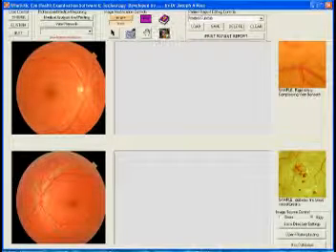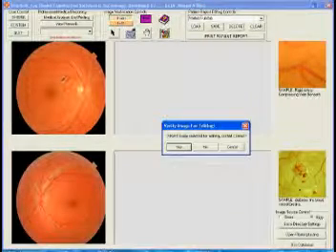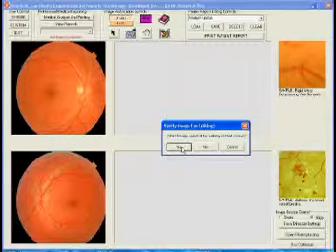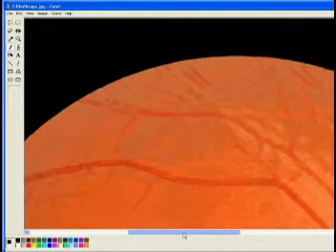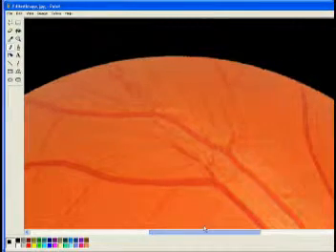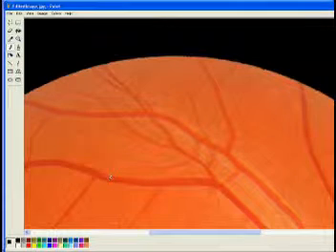I'm going to select this tool here. I'm going to click on the photo. It says right image selected, yes. And now we're going to enhance the image inside the patient. Mr. Patient, here you are looking at an enhanced view of the inside of your right eye. It's about 1.5 inches inside your head. These are dark vessels, veins. The light ones are arteries.